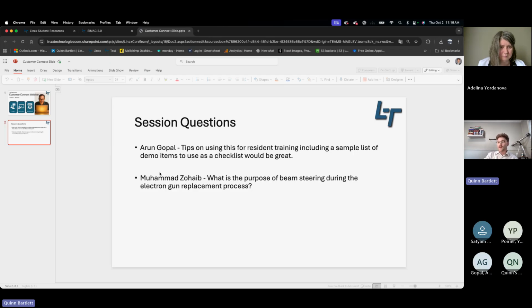And then we have a question from Mohammed, which is great. Thanks for asking, Mohammed. Mohammed took our service courses a couple years ago, so I'm glad to see you're still interested in Linacs, and he asked, "What is the purpose of beam steering during the electron gun replacement process?"